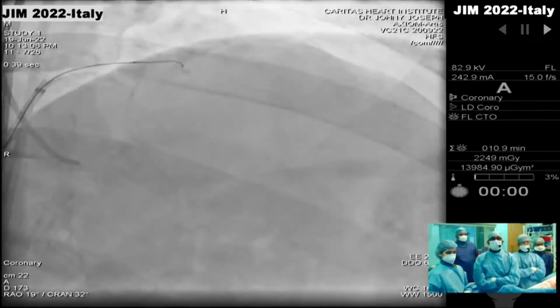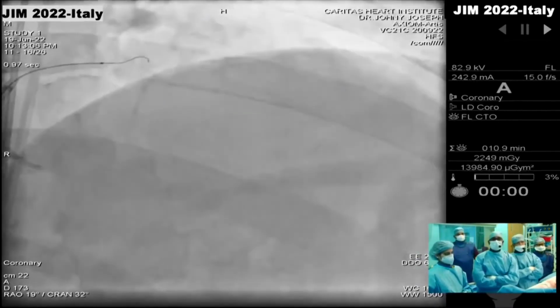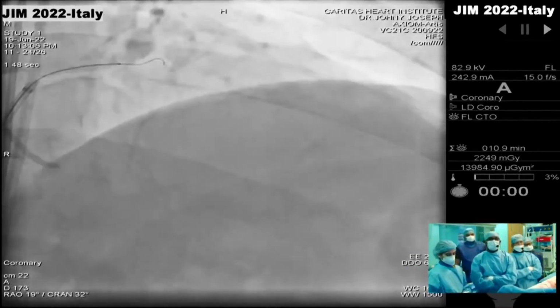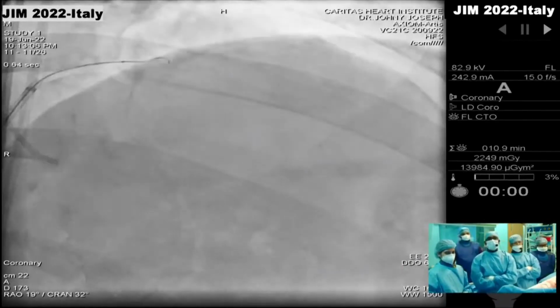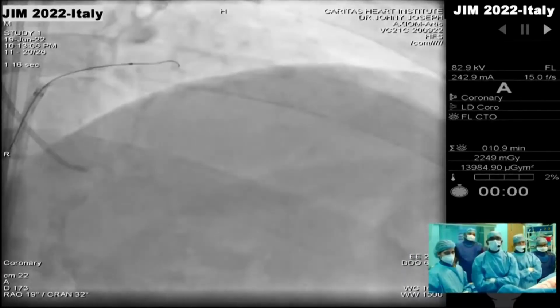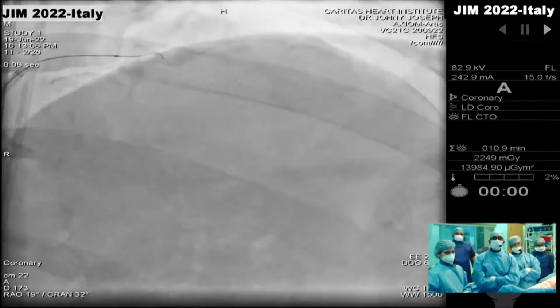Well, so we started off with a microcatheter and a Versaturn wire. With the help of a Versaturn wire, we tried to probe that particular lesion, and we made out that the wire wouldn't go through. So we switched over to a Fielder XT wire, hoping that the Fielder XT might go through. That's the Fielder XT wire. It was buckling over there. It wouldn't cross the lesion.